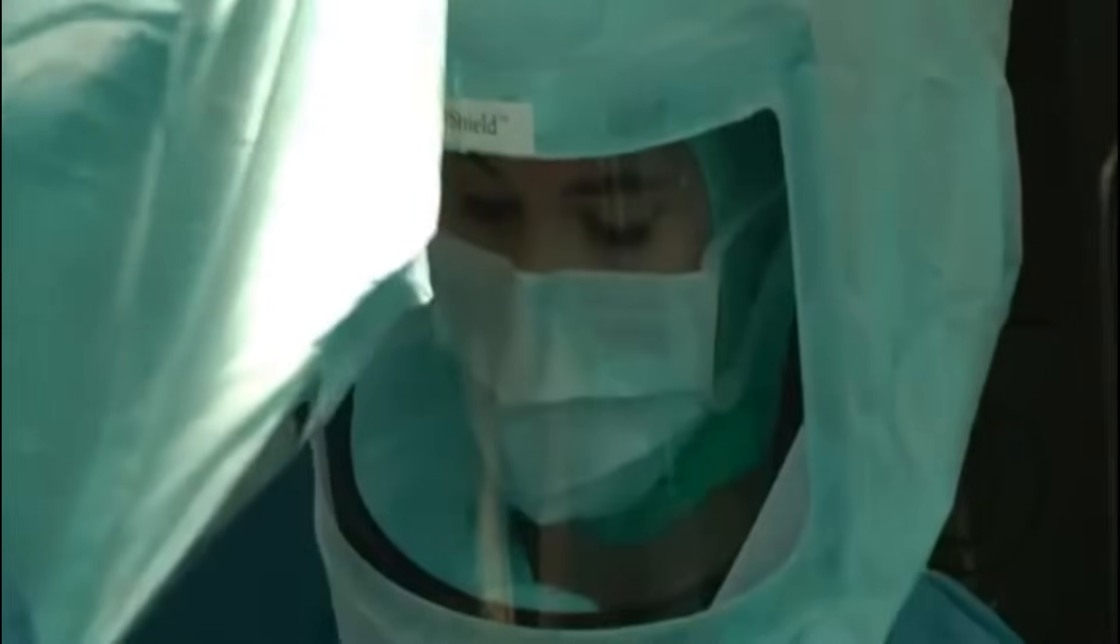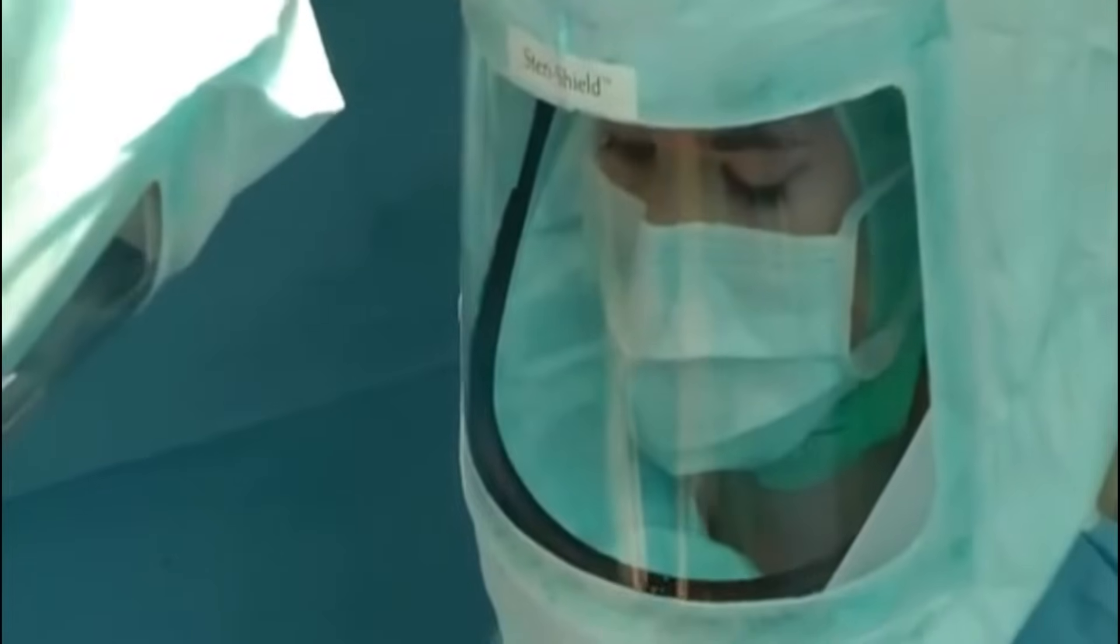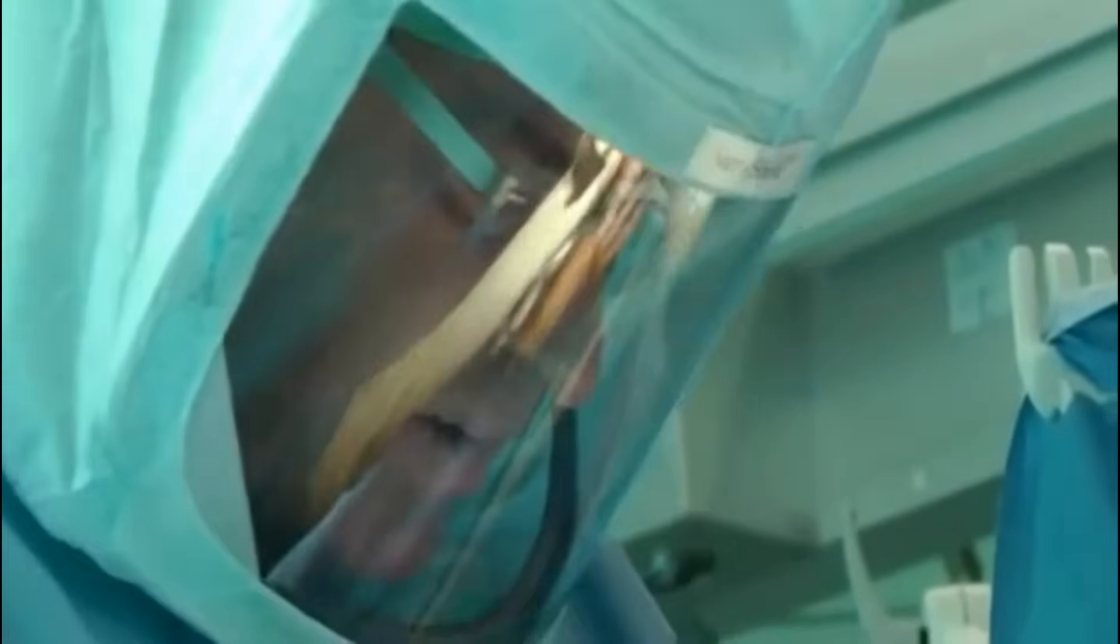Many of my patients ask me, how do you get this implant inside of me? I'm going to show you in a minute. Don't be afraid of my assistant and my scrub nurse wearing the typical astronaut's helmet system. This is another means against infections, because the air of the surgeon is filtered away by this helmet.